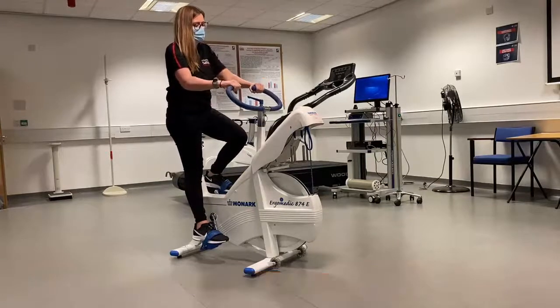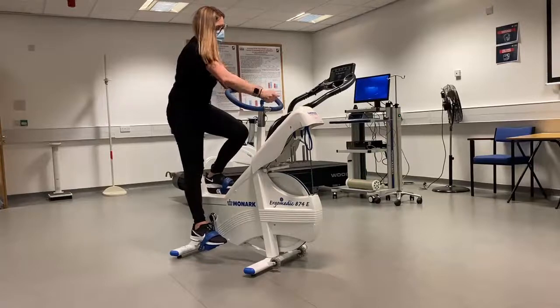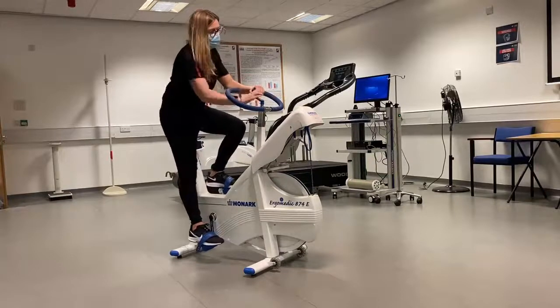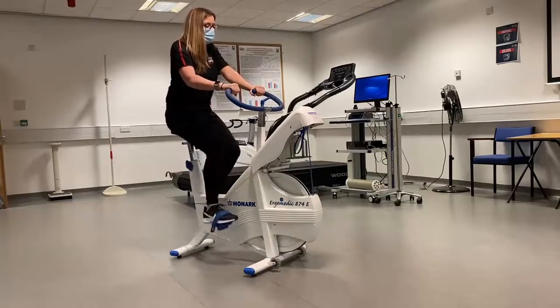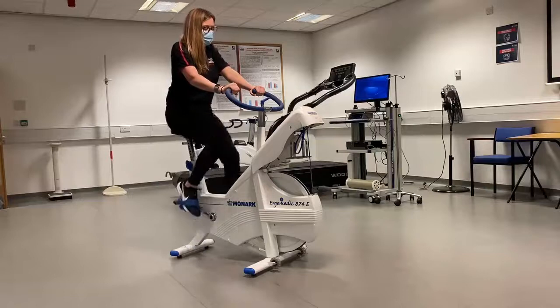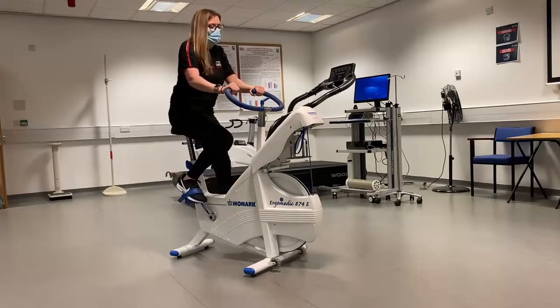As well as seat height, the handlebars can be moved up and down and positioned closer or further away by using the release lever. Once loosened the handlebars will drop, so hold on to the handlebars while you do this. Once at the desired position, ensure you fully tighten the lever to maintain the handlebar position.